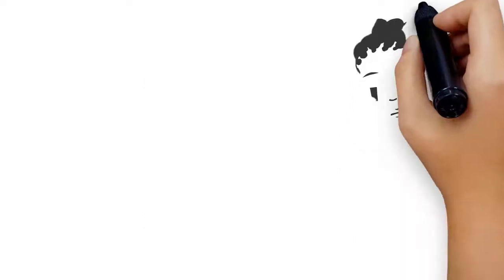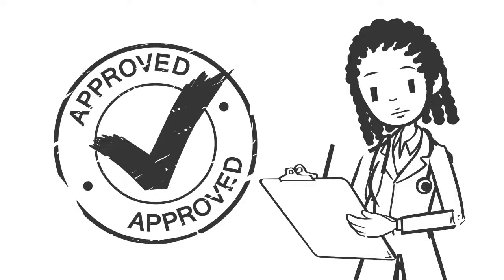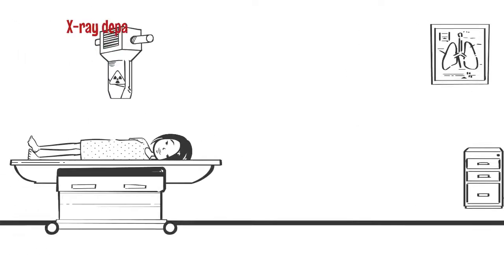Before the CT goes ahead, an imaging specialist will look at the request and decide whether it is the right test for you to have to find out why you are feeling unwell. They will then pass the request to a highly trained radiographer to carry out the scan.